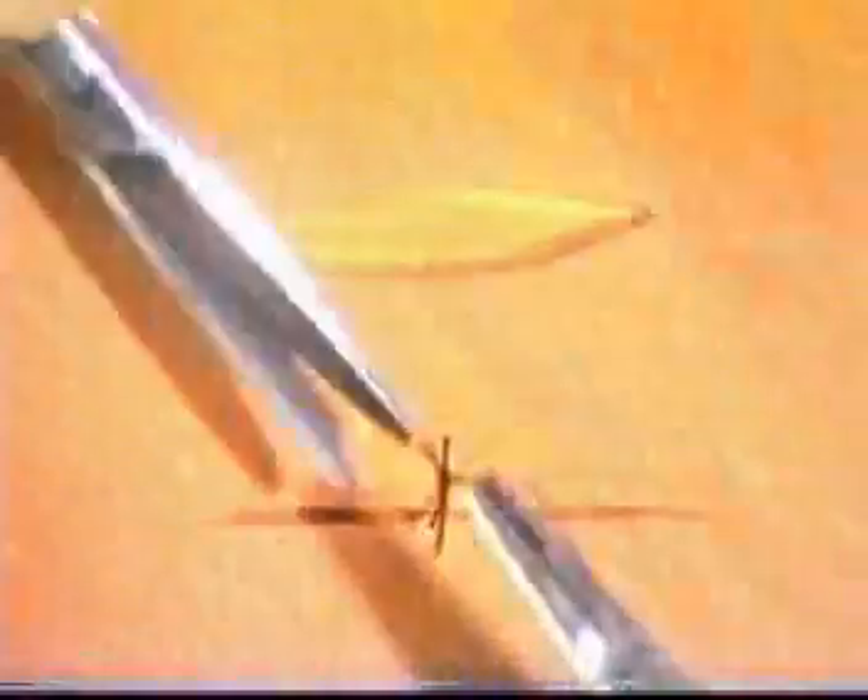With these simulated pads, the tissue is often very springy, more so than normal skin — make allowance for this during your exercises. Once the initial suture has been placed, it is then easy to halve the remainder of the incision on each side to continue to close it. Insert one suture halfway along the remainder of one end of the incision, and ligate this.